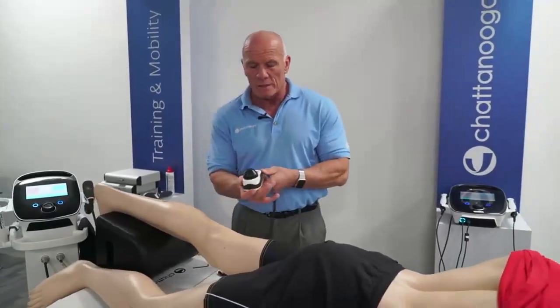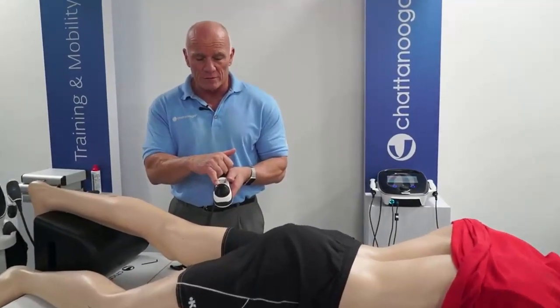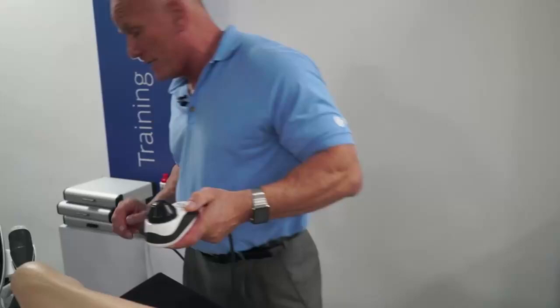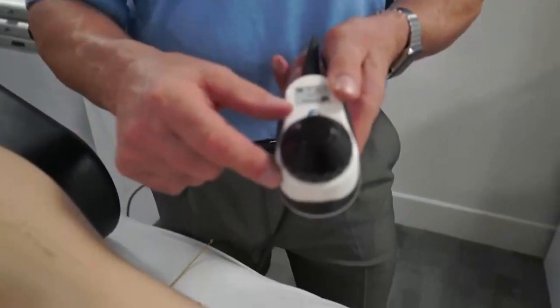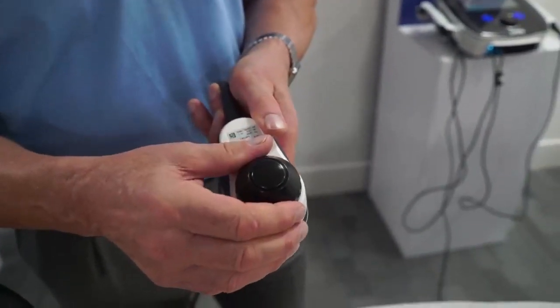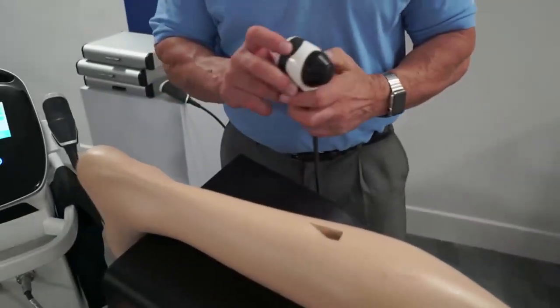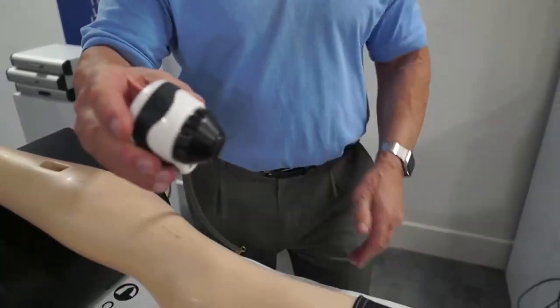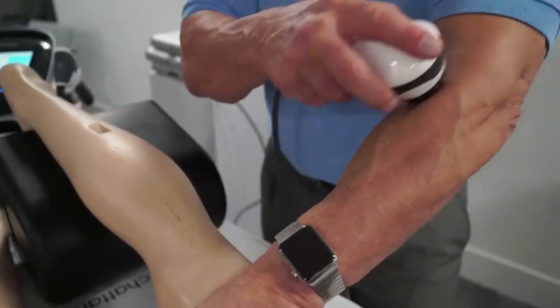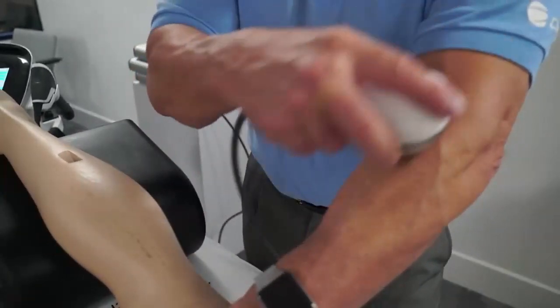You have 2 standard heads, the 25 mil here, and then we've got the 40 mil for bigger muscles, and you do have the option now of a smaller one which is 10 mil in size, and if you want to hear it, it sounds like this. Don't need gel because we have a ceramic head. It slides nicely up the body and it feels fantastic. It really, really works nicely.